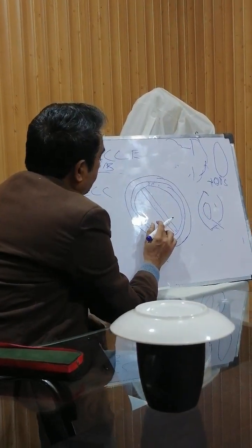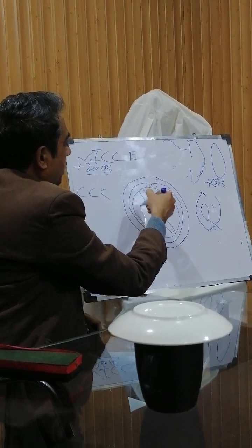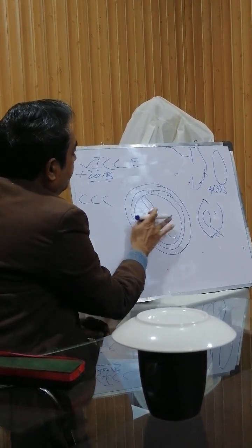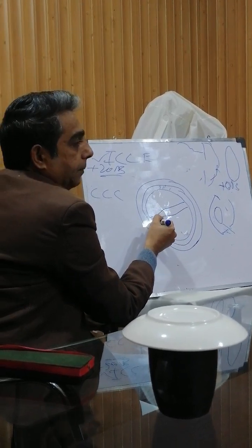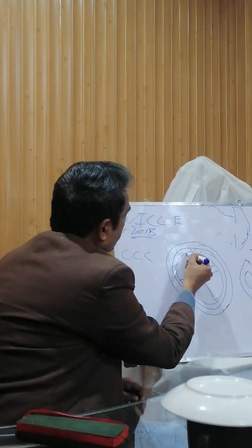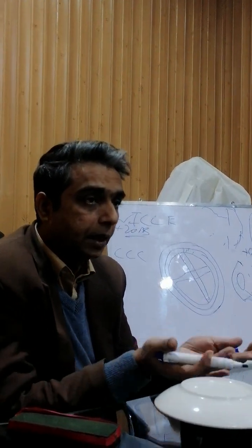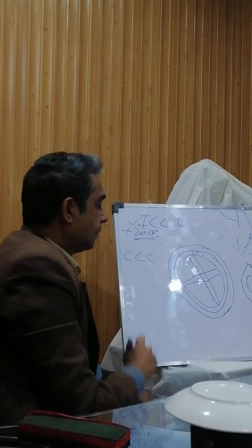And then we do it again. Then we rotate the nucleus in the bag, and after rotation, this groove has come to here. Okay. Now we again make another groove, and make another groove a couple of times till we can see the fundal glow of the retina or choroid from behind. Now behind this nucleus is again the posterior capsule.